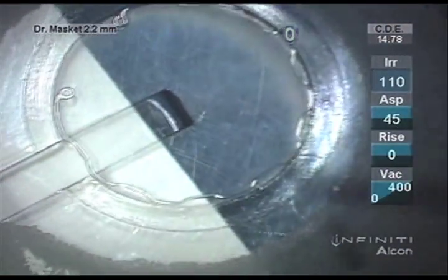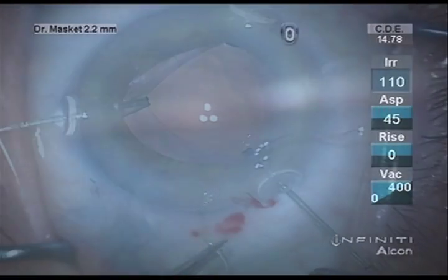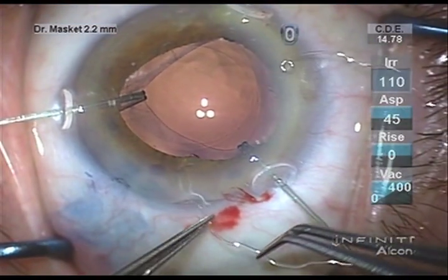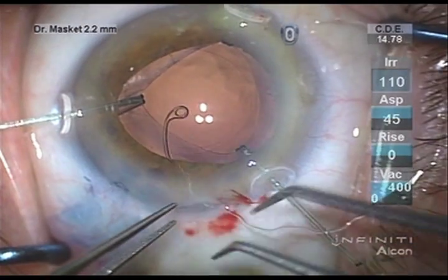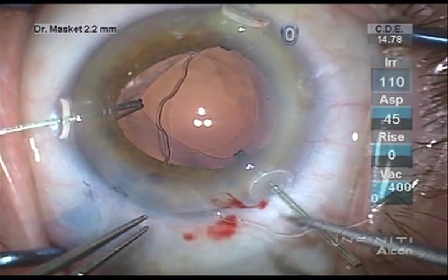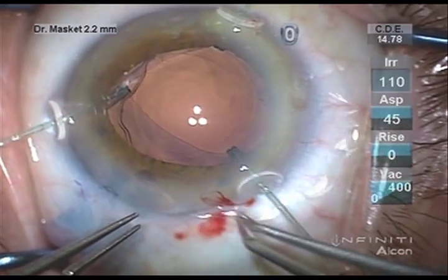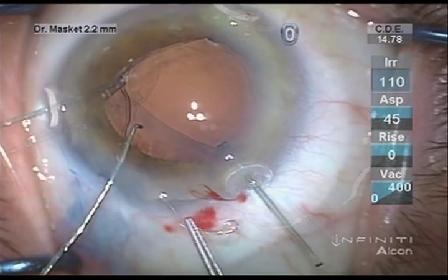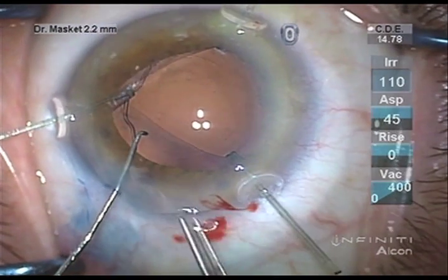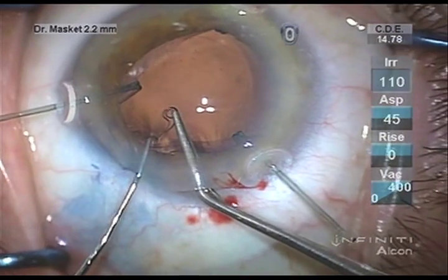The capsule bag has now been fully emptied of its contents and a CTR is placed. I had called for the Henderson modification to enhance my ability to remove cortex in the presence of the ring. However, given that the Henderson ring was selected, I placed it at this time instead of a standard ring. It has the same advantages.